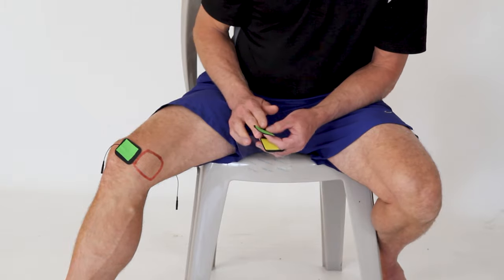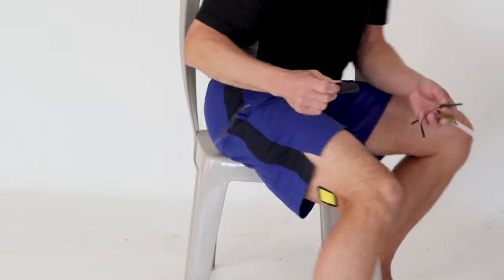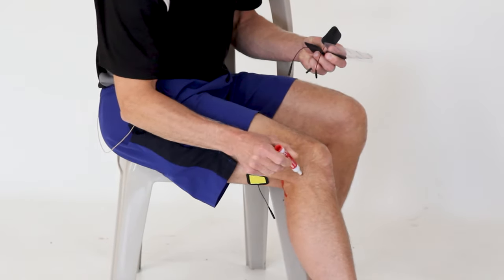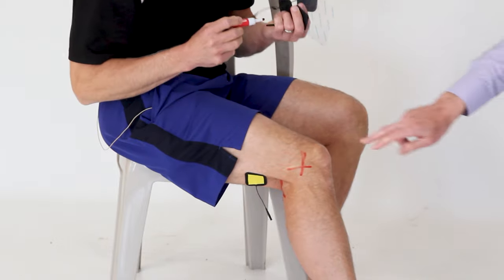We won't do that. All right, let's go to the lateral, Brad. It's the same thing on the lateral. You're going to first try, let's say the pain is here. I'll put an X on it. You're going to try one on the pain.